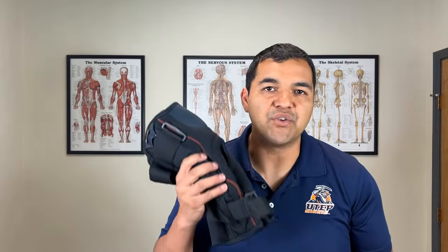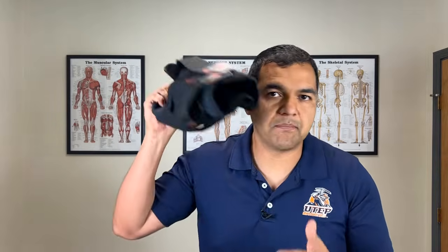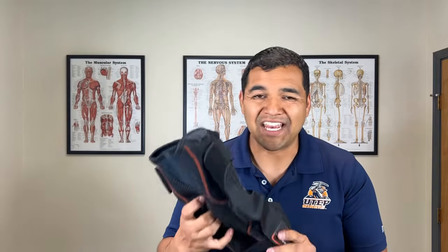Another pro about this is you can hand wash it in your sink. That's how you should do it. Just get a little bit of laundry detergent, plug up your sink so that you can create a little bit of a bath in there and just wash it, rinse it on itself, and then dry it up in your shower or wherever you want. They don't recommend you put this in the dryer, but you can dry it out in the sun if you have access to somewhere where you can put it out, and it should dry fairly quickly so that it's ready to go for the next day.